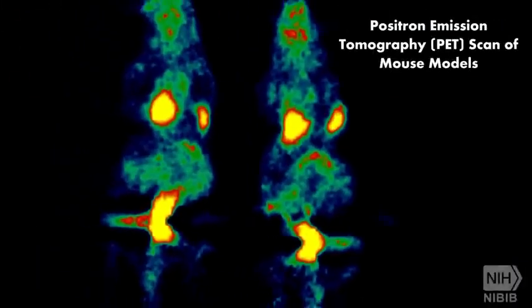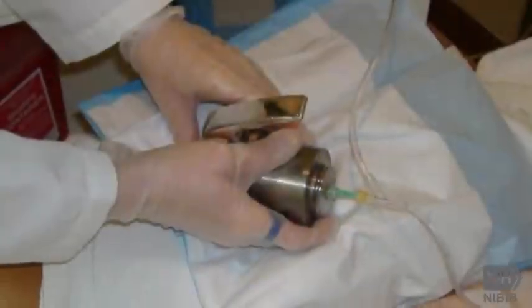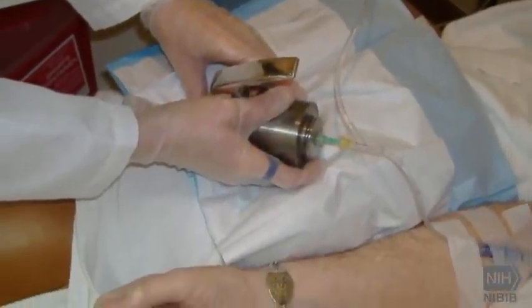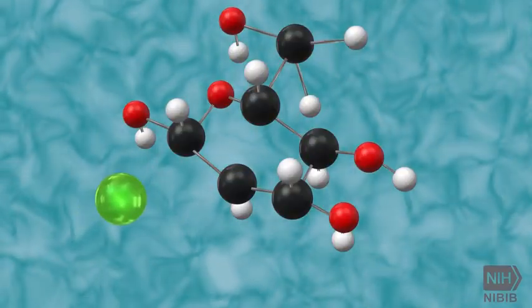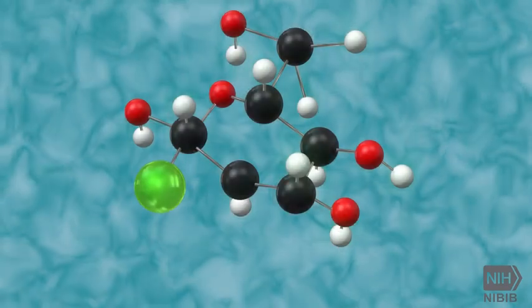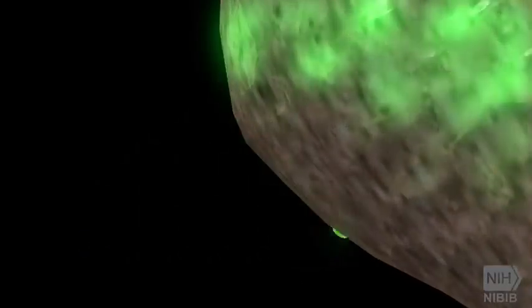PET scan creates 3D images of the body. It does this by using radioactive tracers, which are usually administered to a patient through intravenous injection. The tracers are made up of carrier molecules that are tightly bonded to a radioactive atom called an isotope. The carrier molecule can interact with or bind to specific proteins or sugars in the body.